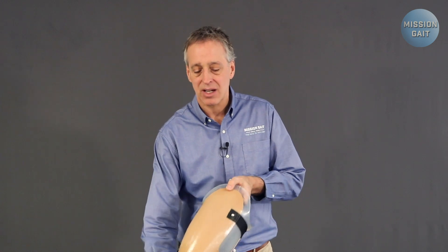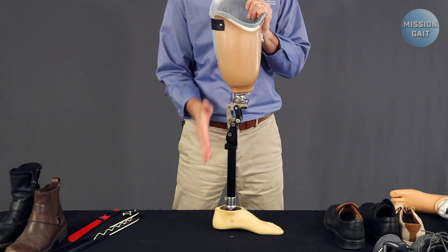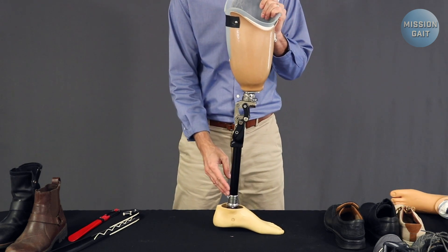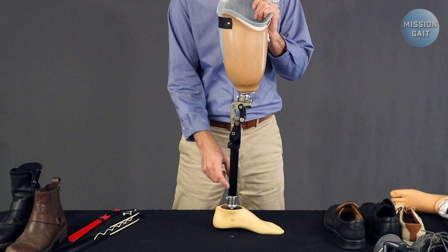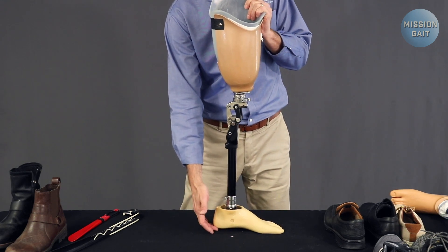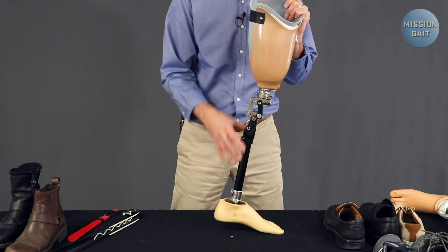The vertical pylon concept is important — it establishes whether you've got the right shoes. If you look at this pylon, it is vertical, meaning the device is set up with balance. If it's leaning back, it becomes unstable and the patient risks falling backwards. If it's leaning forward, it makes the knee want to buckle and the device to potentially collapse. You always want the pylon to be vertical. To test new shoes, put them on the prosthetic foot, set the foot on a table, and make sure the pylon is vertical. If it leans posteriorly, put wedging under the heel; if it leans forward in a high-heeled shoe or boot, it's too unstable to use.